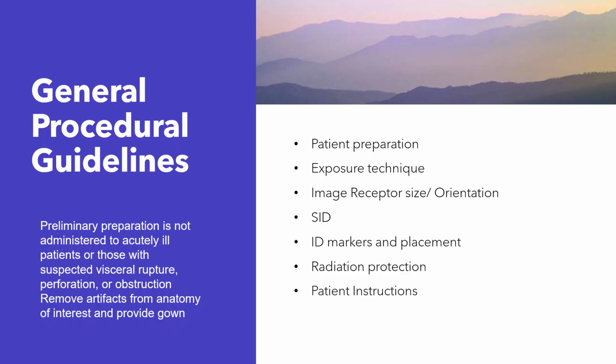Tell the patient to leave their underwear on. Yes, I'm serious. You have to specify that. There are so many people that just like to share, if you know what I mean. So specify that they can leave their underwear on.